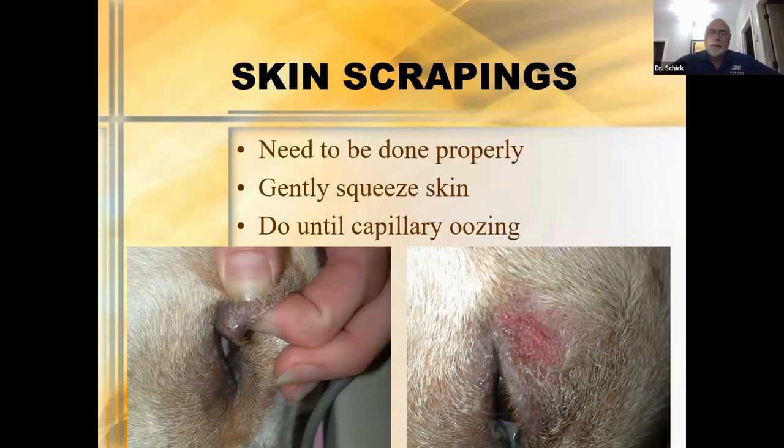People laugh and say how hard is it to do a skin scrape, but after working with many interns and externs over my career, I've been amazed at how many people don't actually do it properly. If you don't do it right, you're going to have a hard time evaluating your results. So how do you do it? You gently squeeze the skin — it looks like someone's squeezing this dog's eyelid — and then you scrape until you get capillary oozing. It seems simple enough, and yet many people haven't done it properly.